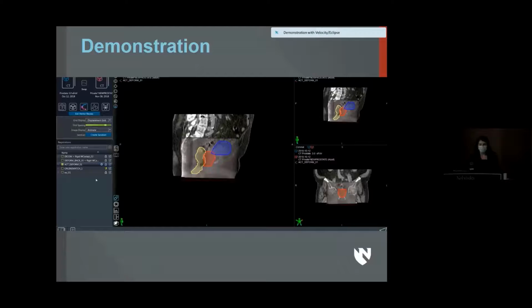Second, I've added an animation so you can see that bladder changing in volume from the cone beam volume to the planning volume. Now the planning volume is supposed to expand all the way out to the blue contour. But if you noticed in that animation, it didn't expand out all the way. So that tells us that our deformation is not a good quality.